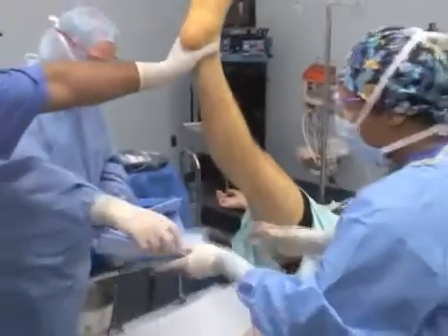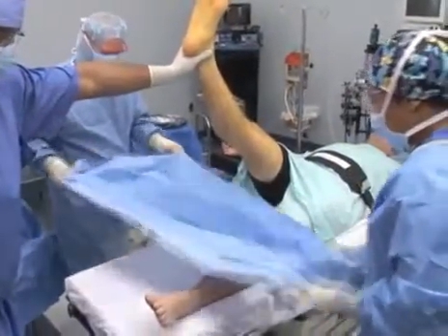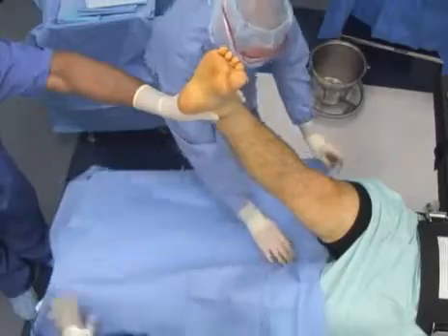Some other areas of the body that are commonly draped for surgery include the leg, arm, and hand. With the limb suspended, a sterile impervious sheet is placed directly underneath the limb.